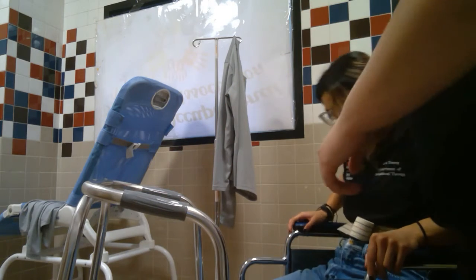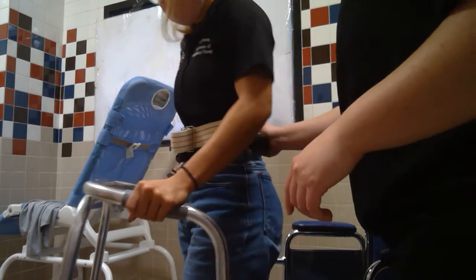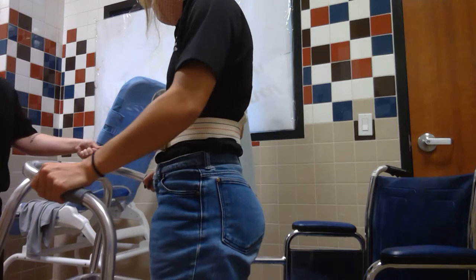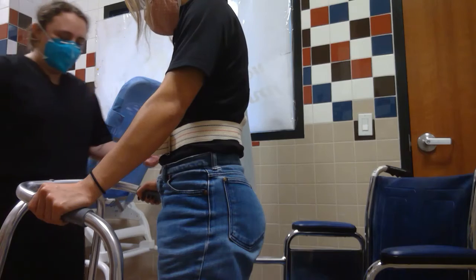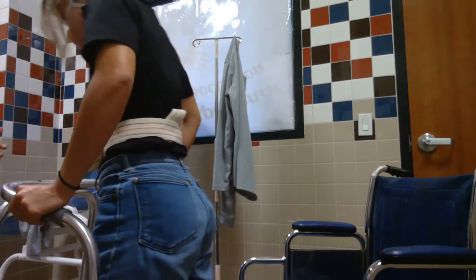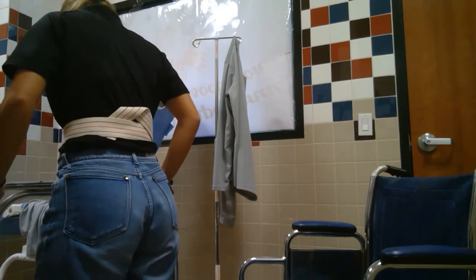Okay. Great job. And so now with the walker, you're going to move the walker first, and then the leg you have surgery on, and then your good one, okay?